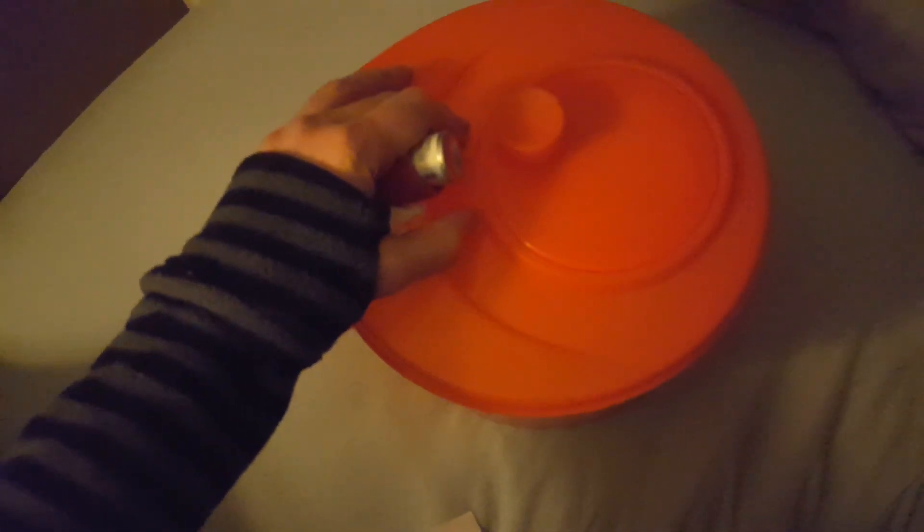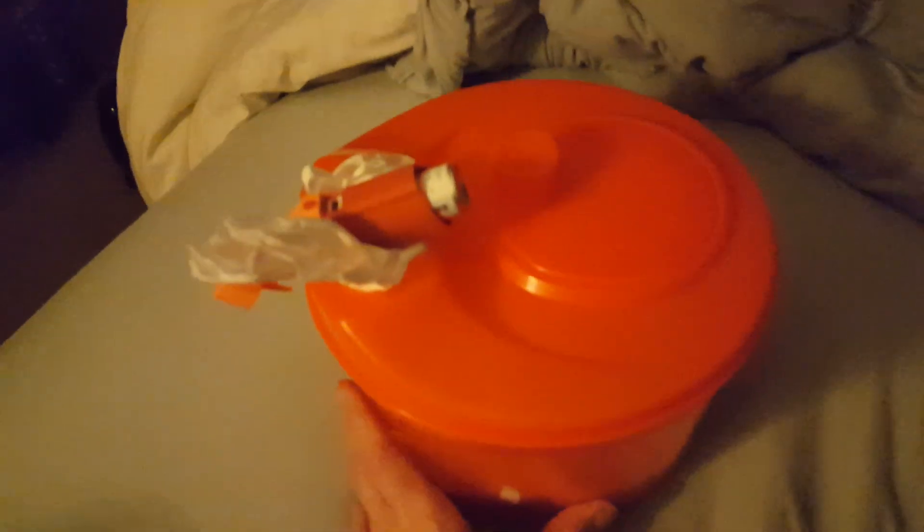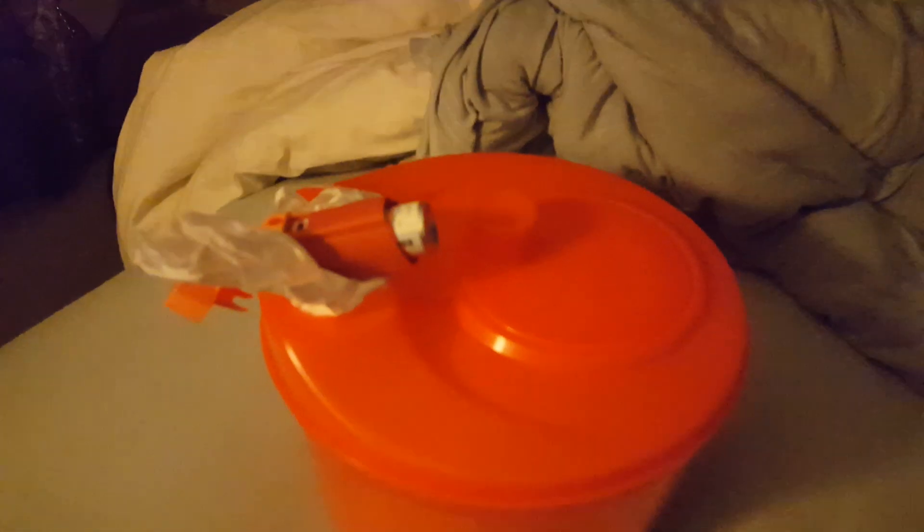The salad spinner is great — you couldn't ask for a better situation. This one has holes on the bottom so I made sure I was on my bed with it to make sure there was a nice seal as we press down, so he doesn't lose the air. He did dig around and try to escape while I was doing this.